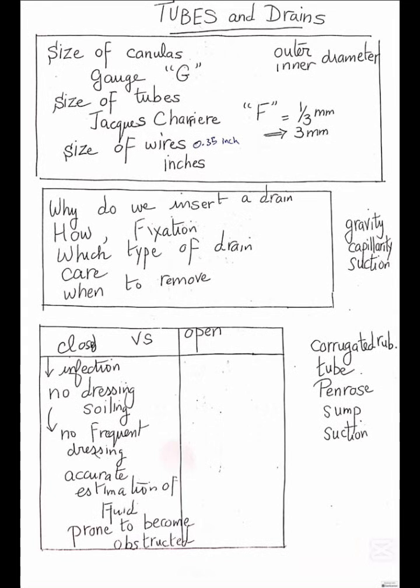Watch out for any signs of infection like redness, warmth, or discharge at the site of insertion. Securement: you have to make sure that the drain is fixed and not tugging. The drain must also be emptied and measured regularly. Nurses document the output and report abnormalities. Drain removal is done once drainage is minimal, usually under sterile conditions.